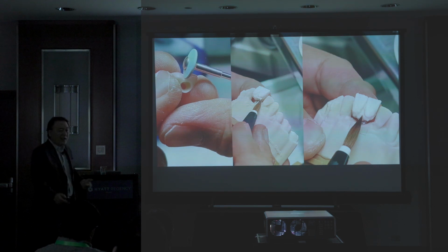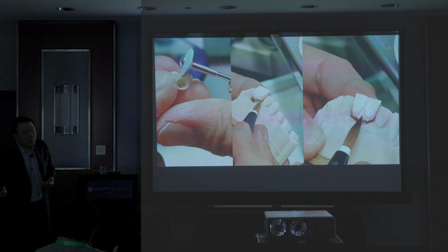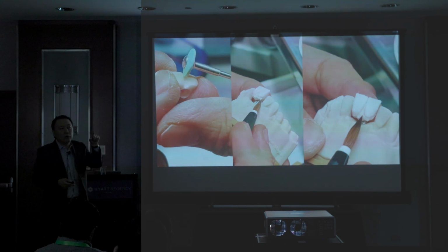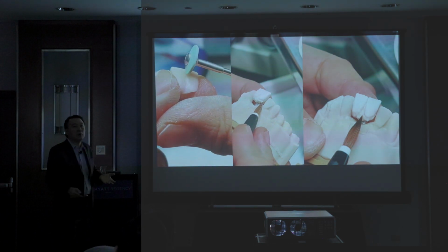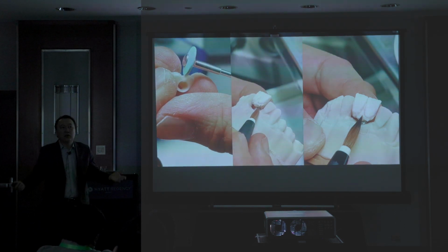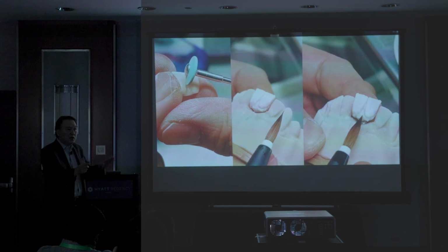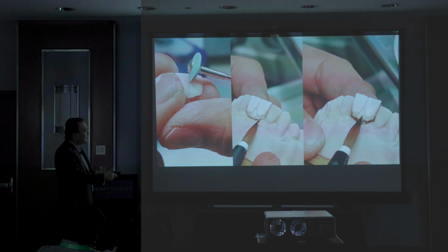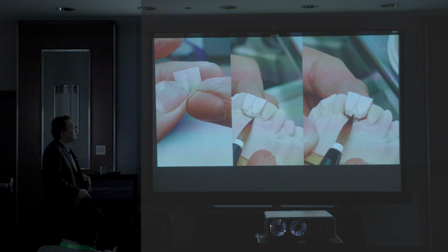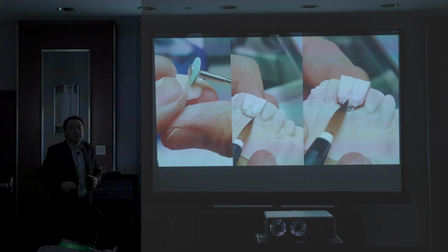I'm always adjusting in exocad, the 3D shape, whatever. Whenever I see the technician's setup, the measurement is different than what I think. Make sense to you? I thought about 4/10 millimeter, but whenever I got this, it's more than 4/10 millimeter. So I have to grind as much as possible. I would say 4/10 is the maximum, then I can make the aesthetic. But that's fine, my designer does a really good job. So I grind here, and add here just like that. You see the almost monolithic? And then build up. This kind of thing I produce daily.